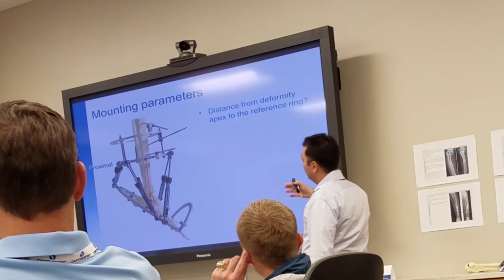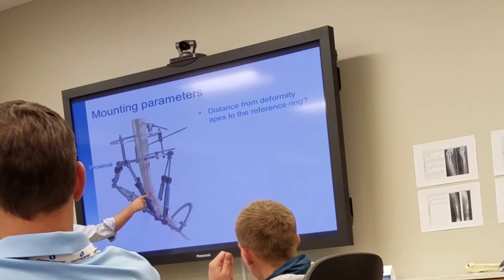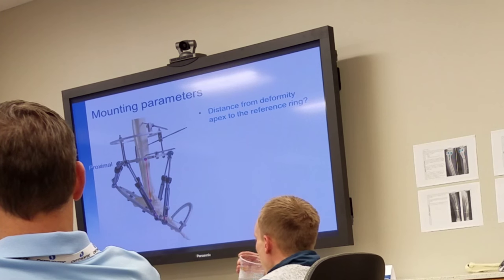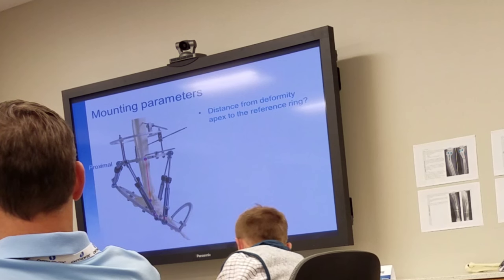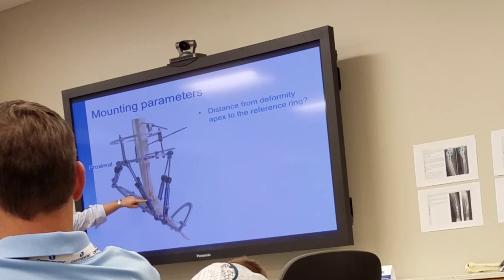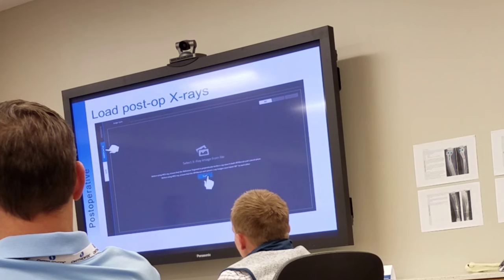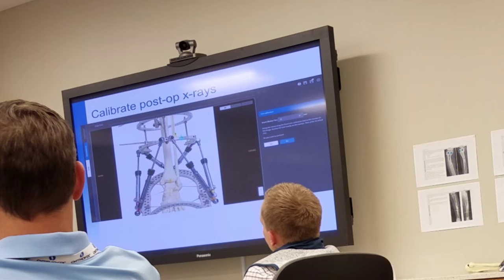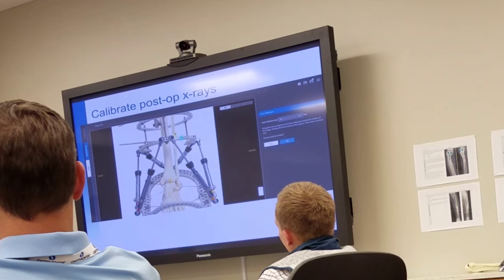It's going to ask you the distance from the deformity. The surgeon may pick the subtalar joint or the ankle joint — that's a difference of about five to ten millimeters depending on surgeon preference. You want to go distance from the apex to the proximal ring. Upload the image — you're going to have to take a picture and upload it, so it's going to take a while to do all these things. Let's go through it step by step, and if you have any questions, don't jump ahead so we can make sure you get each step properly.